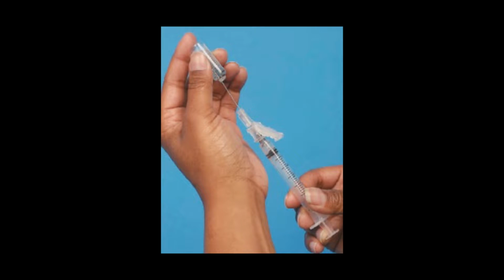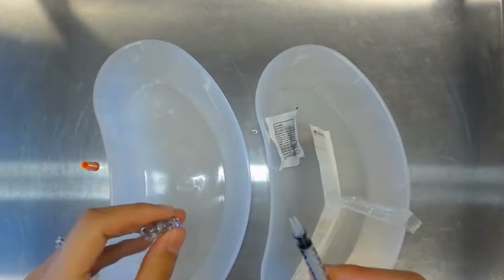Aspirate the medication into the syringe by gently pulling back on the plunger. Withdrawal of the plunger creates negative pressure within the syringe barrel, which pulls the fluid into the syringe.